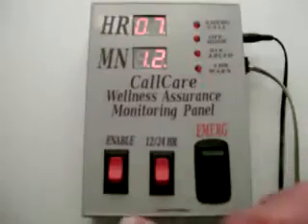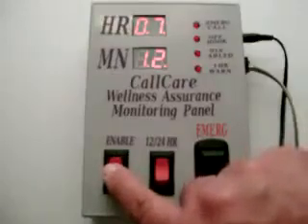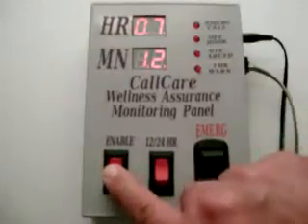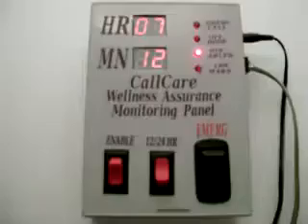The first one disables the countdown from progressing and would be used if you are leaving your residence for a period greater than the wellness interval. Are you going away for the weekend? Toggle the enable switch into the disable position.